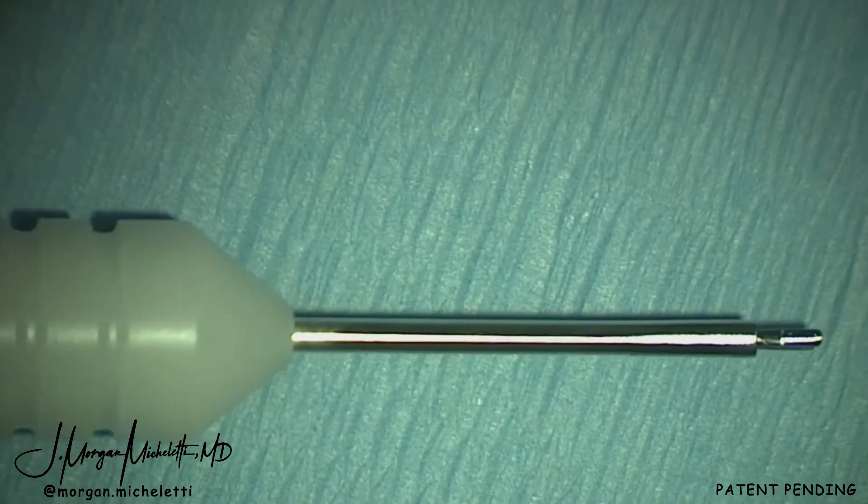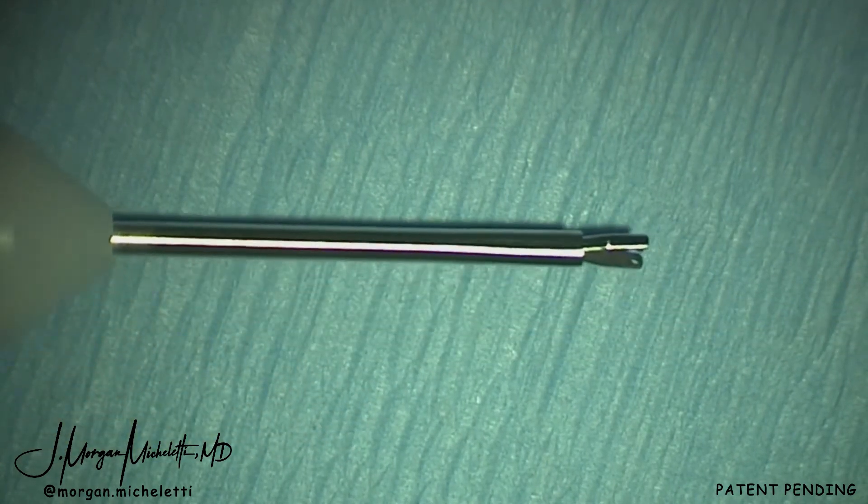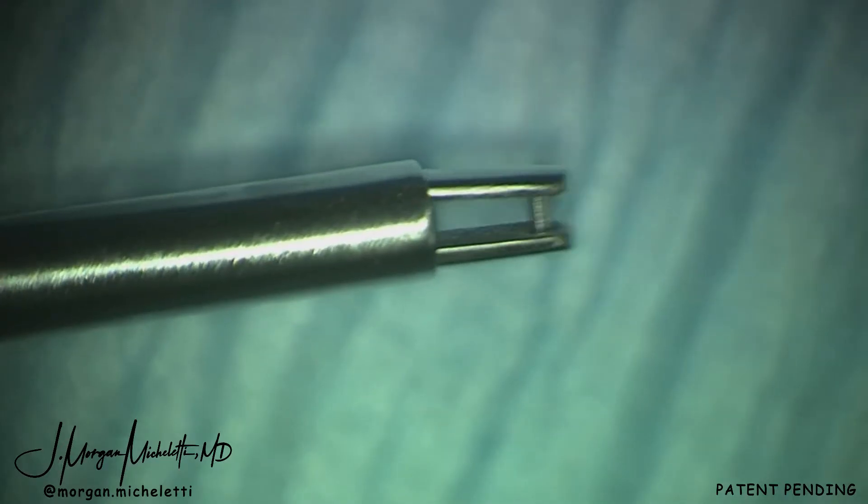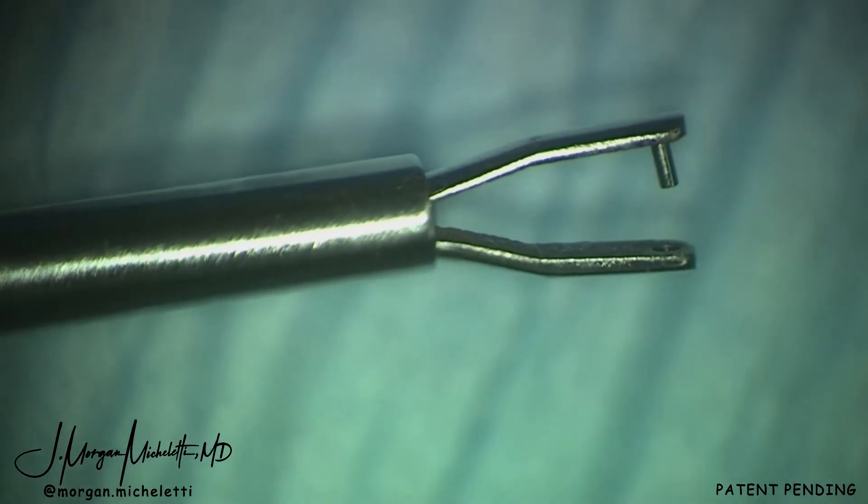This is a new device I helped to create in conjunction with Diamatrix called an IOL punch. It's the first intraocular IOL punch and you can see the action mechanism of that here.